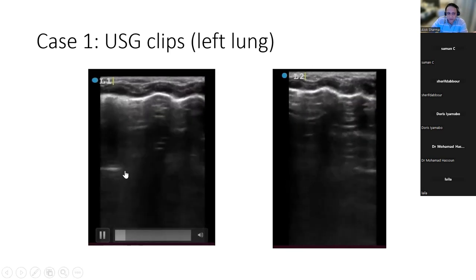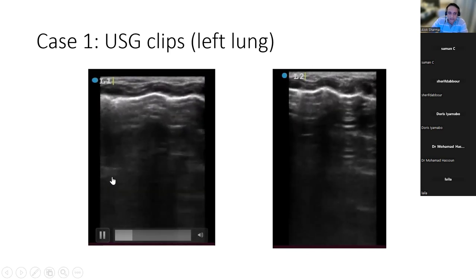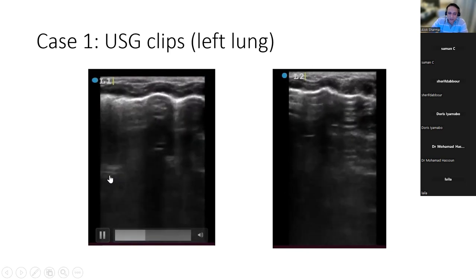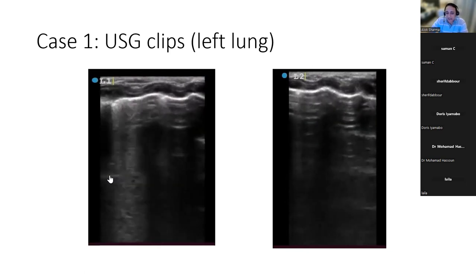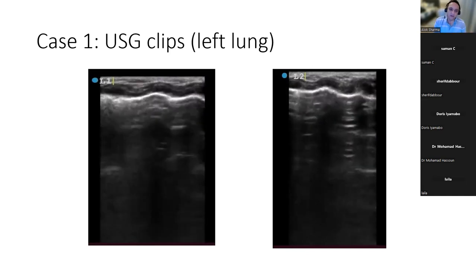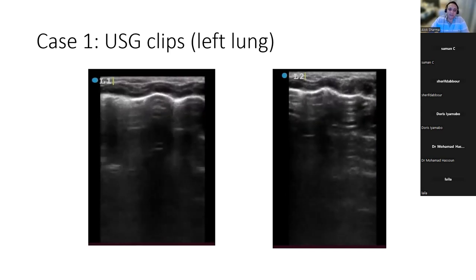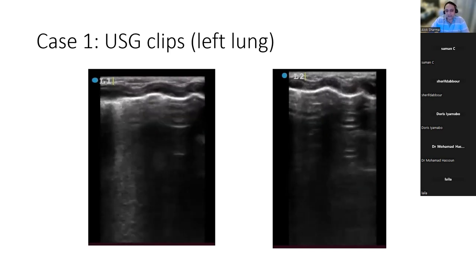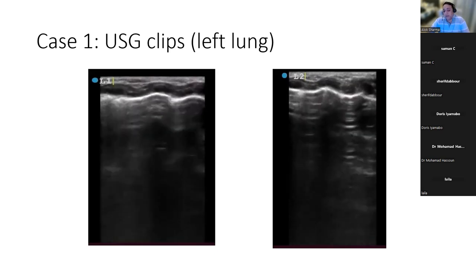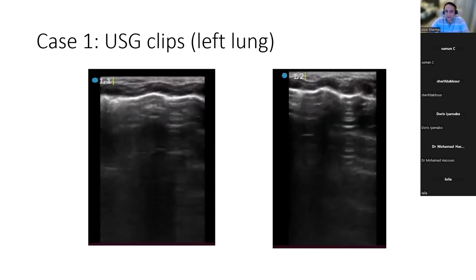there, just to the left. Just move laterally, a little bit lateral. Can you see that white area coming in and out? Yes. So that's a deep consolidation. Remember I said you can find double lung points with consolidation and pneumonia-type presentations. But certainly here, I can't see any evidence of a shred sign or subpleural atelectasis. But again, it's the upper lobe, so I'd just be careful. Sometimes a left upper lobe consolidation can give you exactly this appearance.